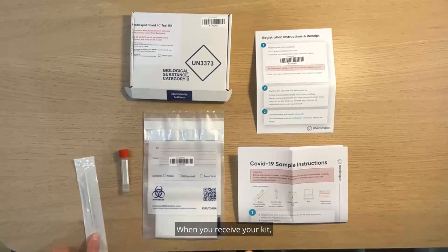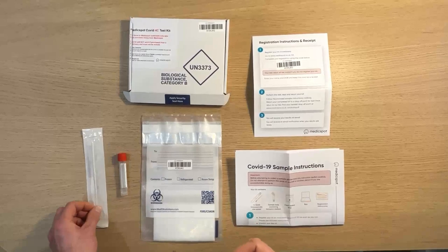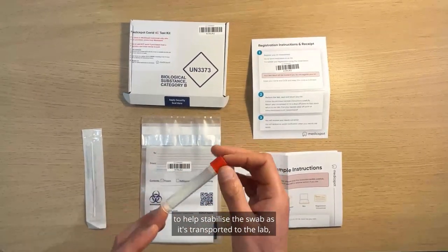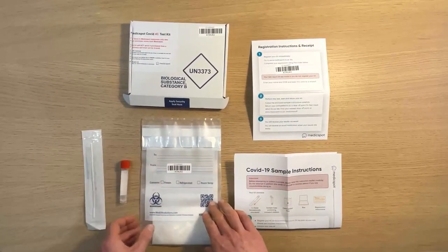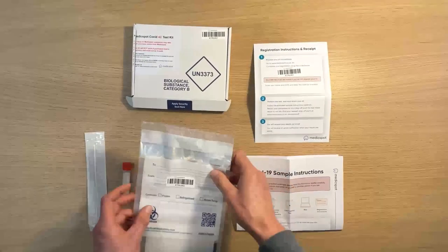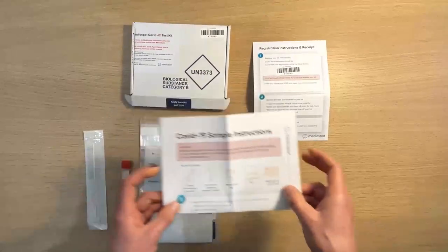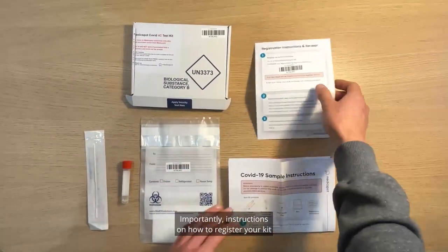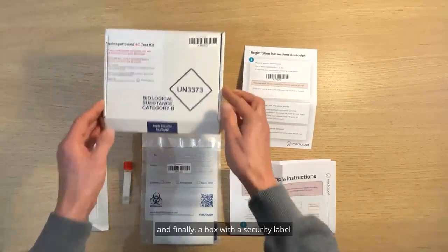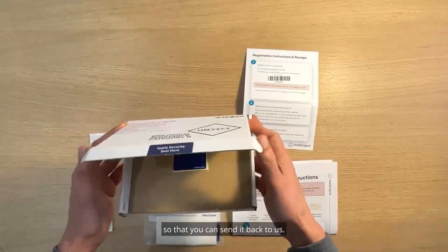When you receive your kit you'll find that it contains a swab or two — sometimes we have a spare. There's also a sample tube containing a liquid to help stabilise the swab as it's transported to the lab. Then there's a clear plastic sealable bag, instructions on how to take your sample, instructions on how to register your kit, and finally a box with a security label so that you can send it back to us.